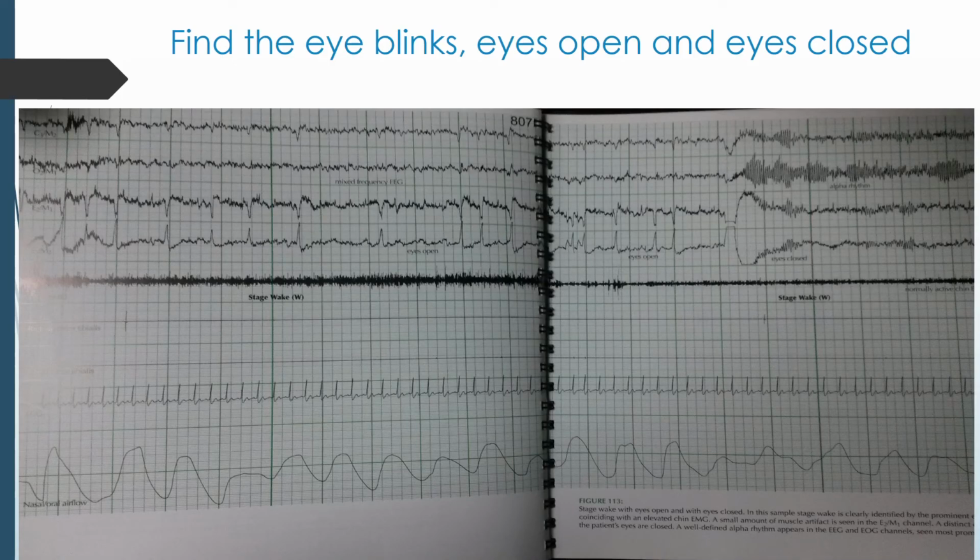Okay, this one here, again, you have your central lobe on the top channel. The second channel is your occipital lobe. Then you have your right eye and then your left eye. Here, this patient is awake. You can see their eyes are open. And anytime where those eye leads look like they're deflecting towards each other, that's the patient blinking, actually.